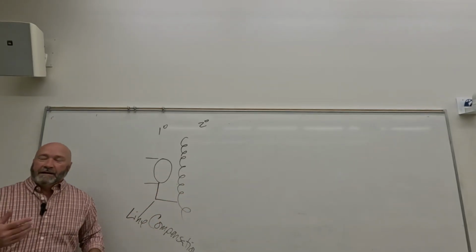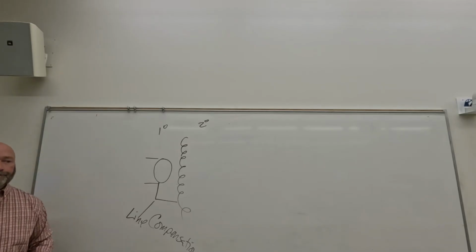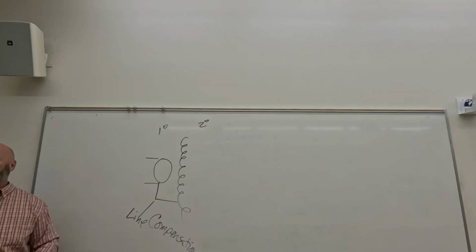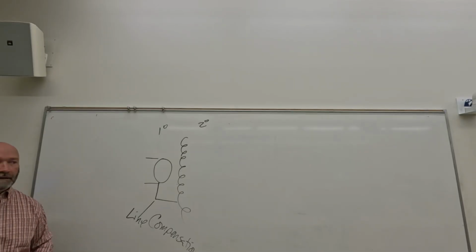You can kind of think of this as a surge protector, but it does more than a surge protector. A surge protector is just that. If you have a surge in electricity, a surge protector protects your electronics from getting zapped, essentially. You get a lightning storm, and if you have a good enough surge protector, it might protect against that.